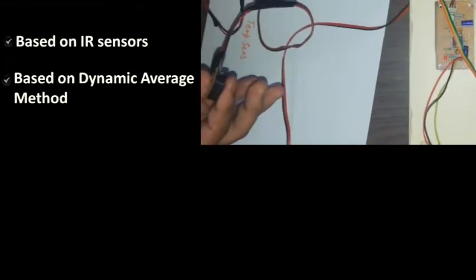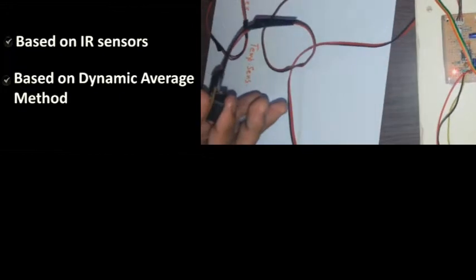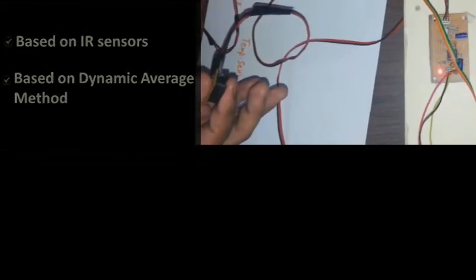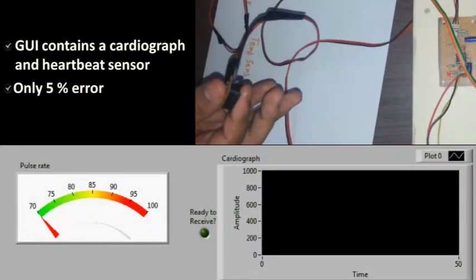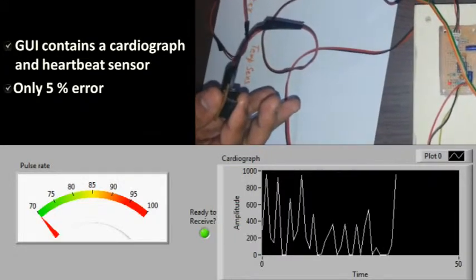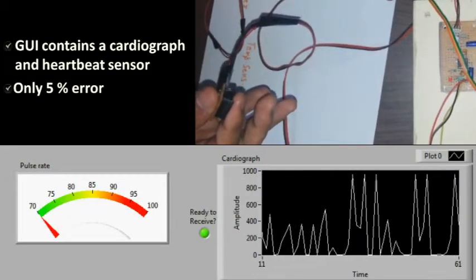The heartbeat module is based on differential absorption of IR light by human tissue as the blood flows through the veins. The pulse rate is calculated by using a dynamic averaging algorithm. The LabVIEW front panel displays the cardiograph and a heartbeat meter showing the real-time variation. The system we have constructed is accurate to within a 5% error.